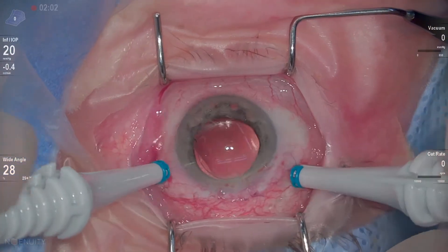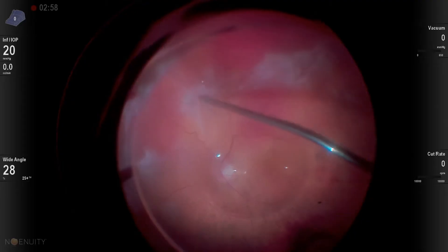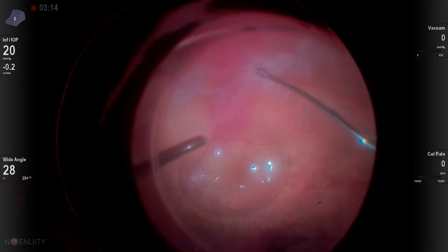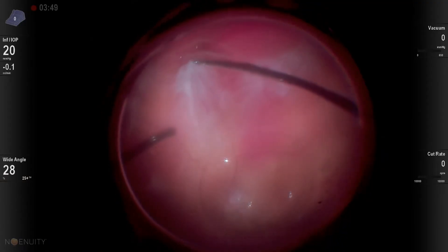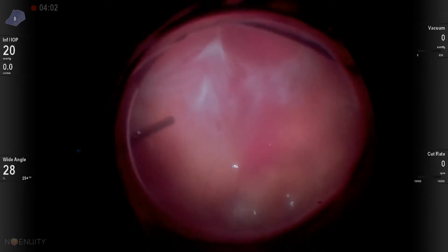I've spoken on numerous occasions about how much I enjoy operating under silicone oil. This is a patient with a recurrent detachment that had some perfluoron left in the eye, and also had silicone oil in the eye. This patient wasn't operated on in our practice, but came to see us for a second opinion, and I had the opportunity to work on their retina.